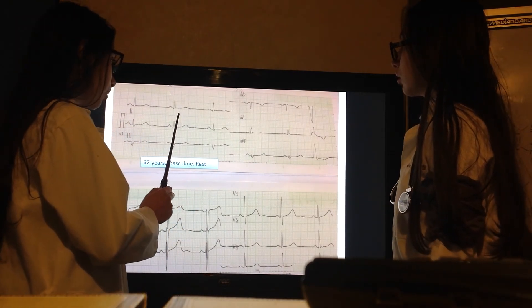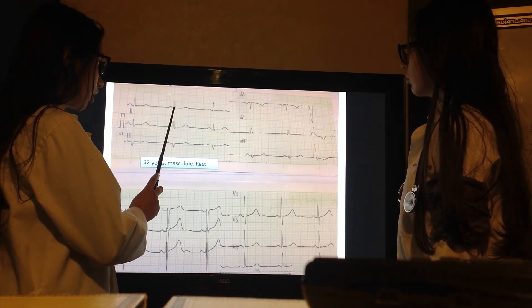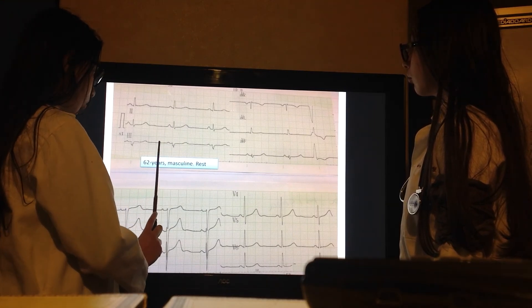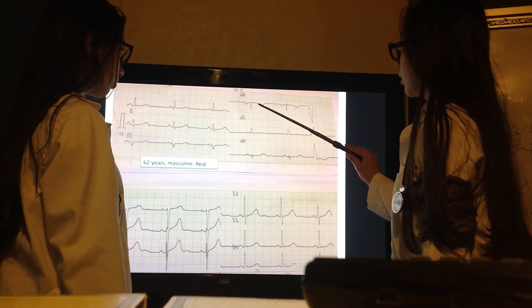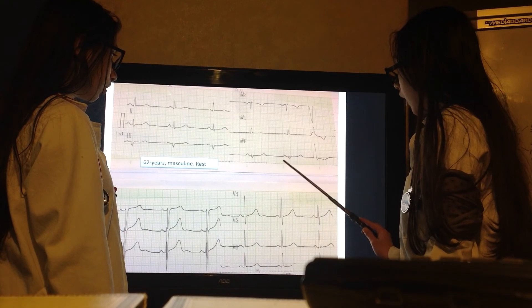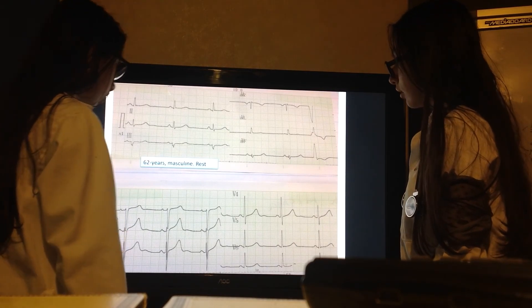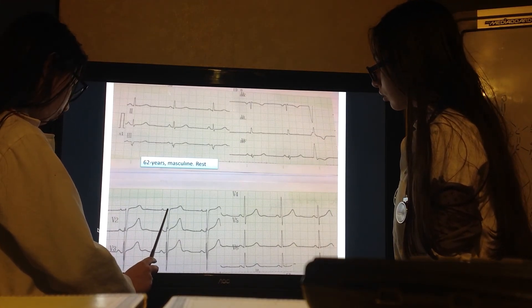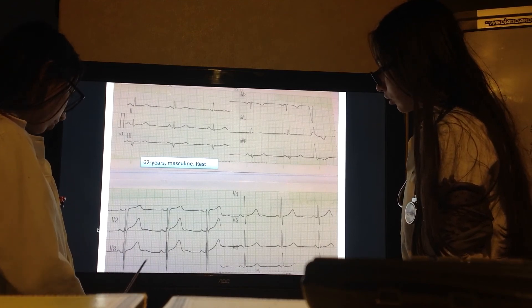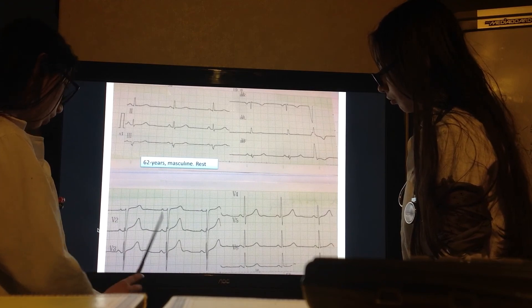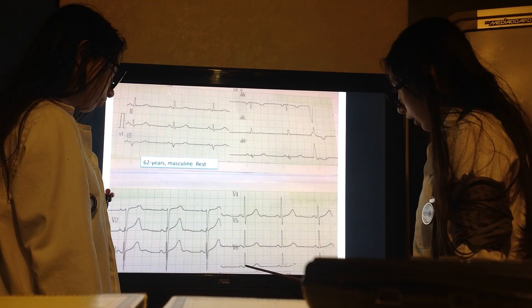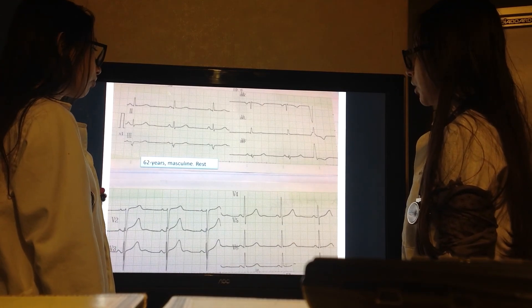Now examining the ST segment at the J-point — the point where the R or S finishes. In the limb leads, the J-point is isoelectric with the baseline in D1, D2, D3, AVL, and AVF. In the precordial leads, V1 is elevated about 0.05 mV, V2 between 0.05 and 0.1 mV, V3 almost 0.1 mV, and V4 about 0.05 mV. V5 and V6 are isoelectric. So there is no significant ST segment depression or elevation.